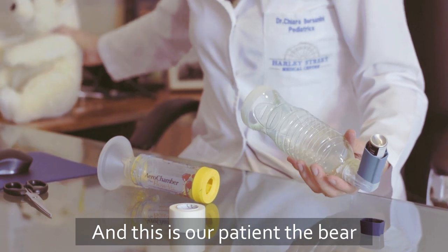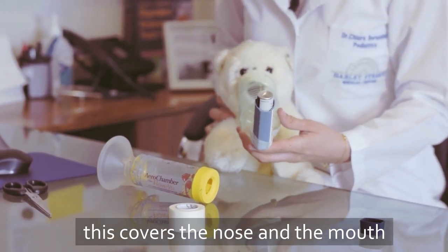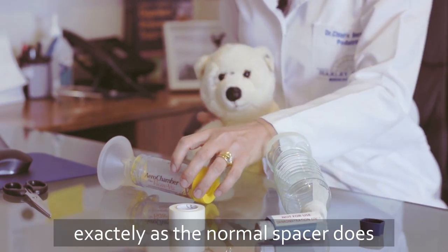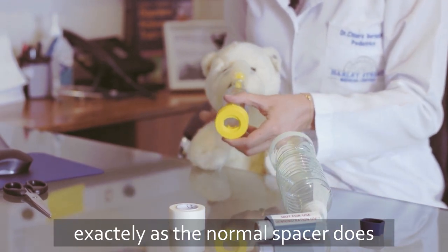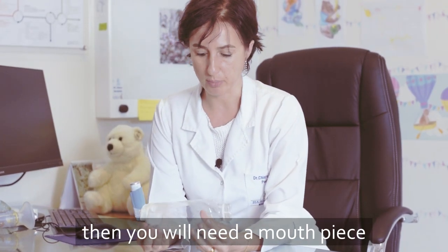And this is always our patient, the bear, which is the small kid. And this covers nose and mouth exactly as the normal spacer does. If your kid is older, then you're gonna need a mouthpiece.